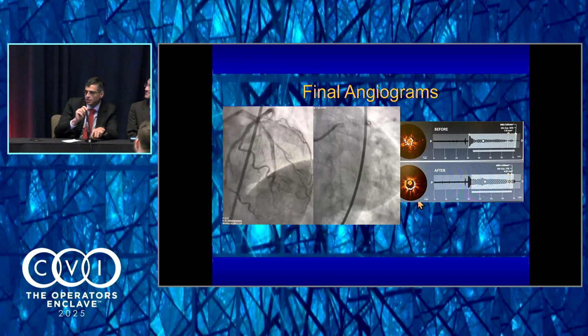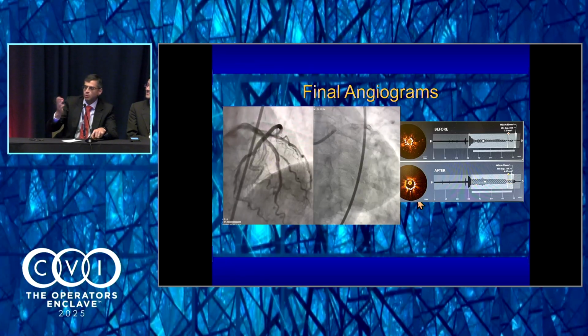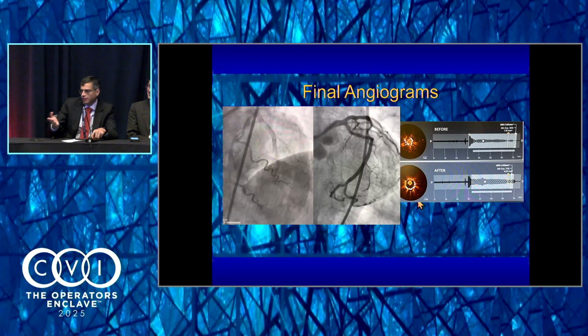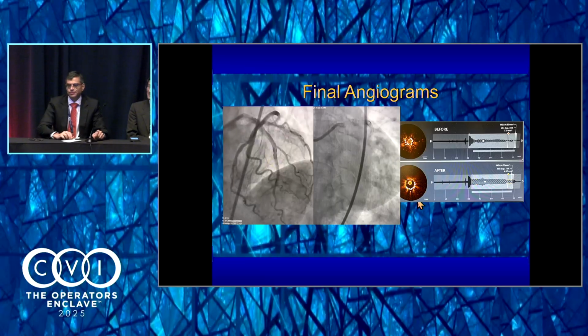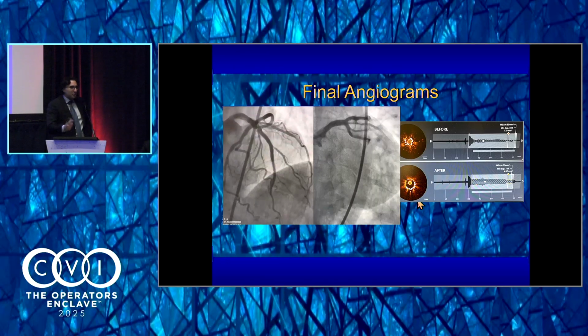Okay. I think that this mid LAD in a man, I mean, it's not going to be a 2.5 vessel. Oh, it's a woman, whatever. Yeah, but still, I mean, it's not going to be a 2.5 vessel. No, I see your point. So that being said, I agree with you.